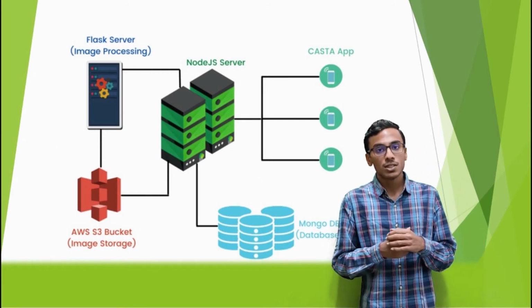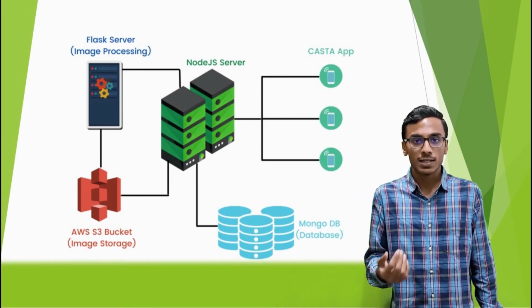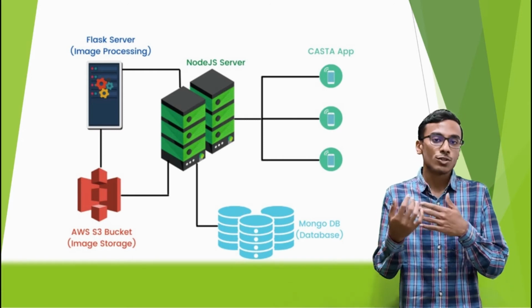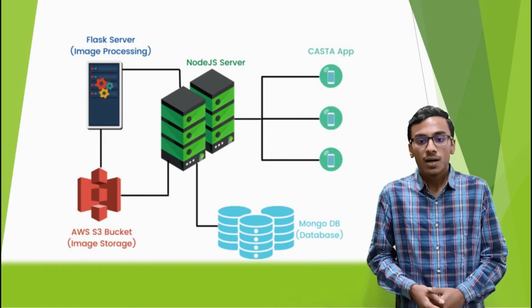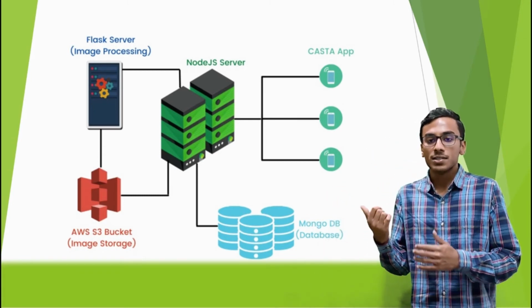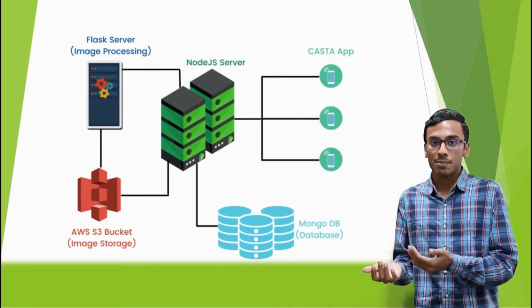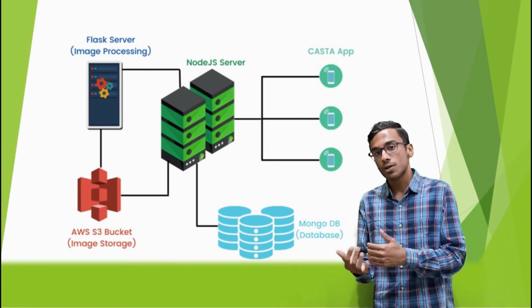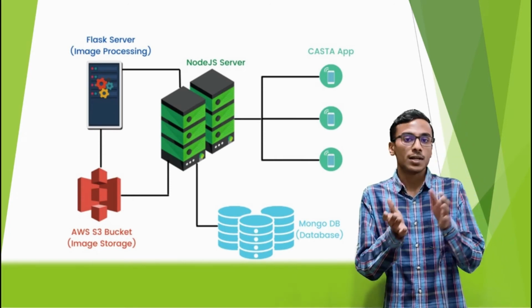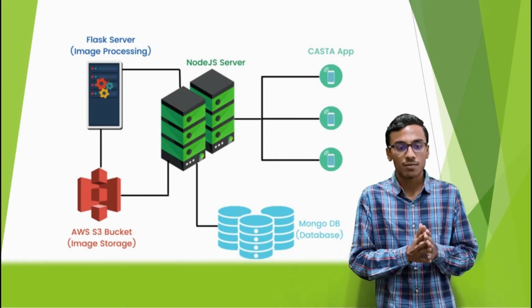We have deployed both the Node.js and Flask servers in an Oracle instance which runs 24/7 so that we have good uptime and users can use it anytime they want. We use Expo in React Native. It is a library which will convert all the code that we have into build files, which can then be sent to the iOS and Android app stores.